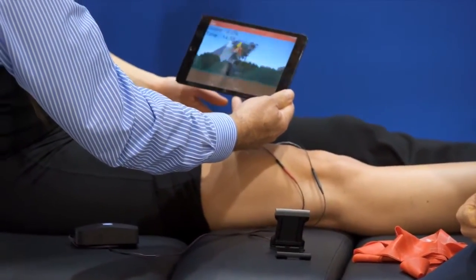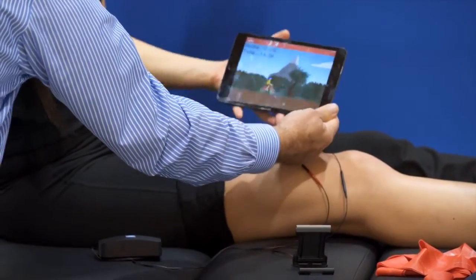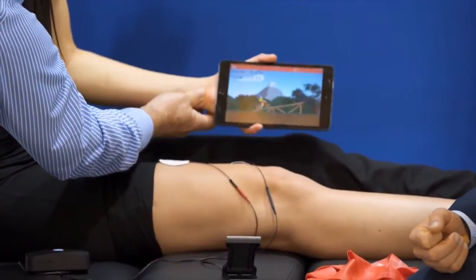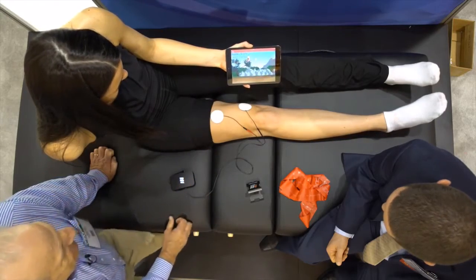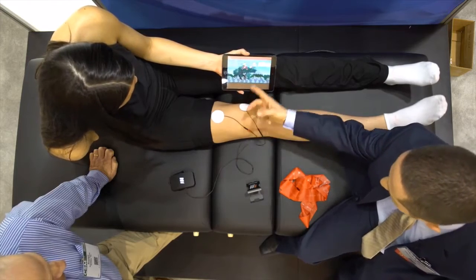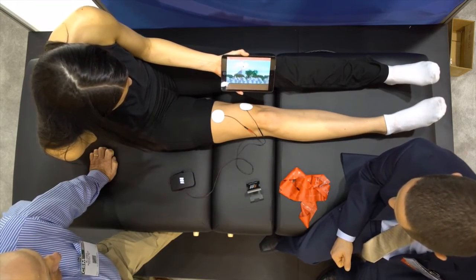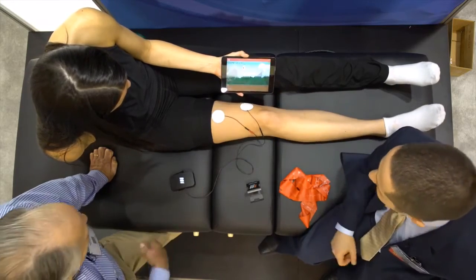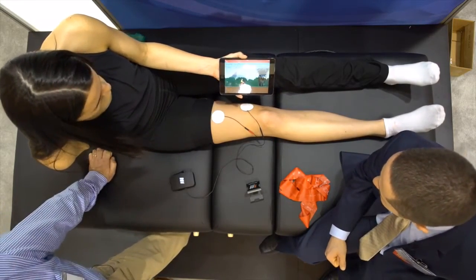Squeeze your muscle and you get the bike to go up in the air — hold it there. You're about to go up the ramp. Squeeze hard, you've got to keep it up there to catch all the stars. She's keeping her quad engaged. Now relax for a second, then squeeze hard again and rest.